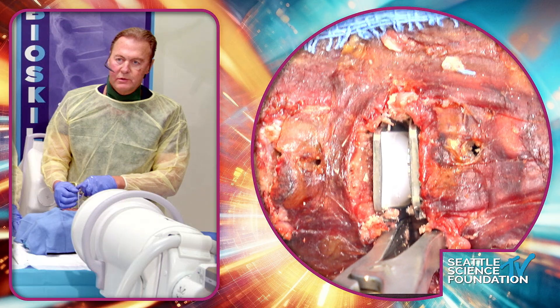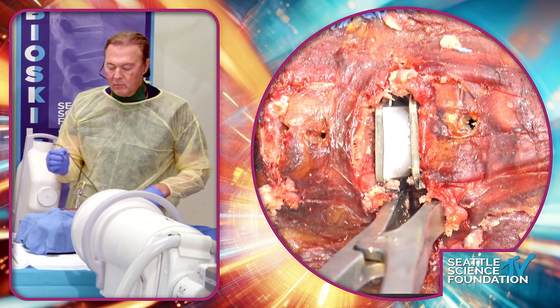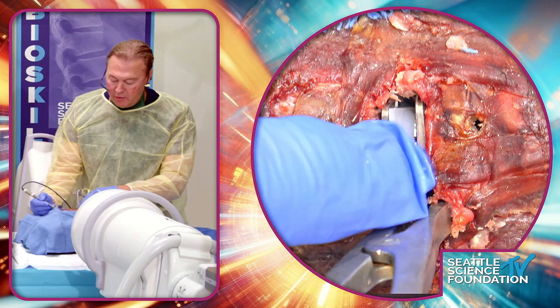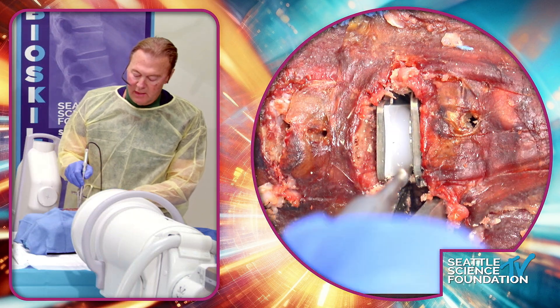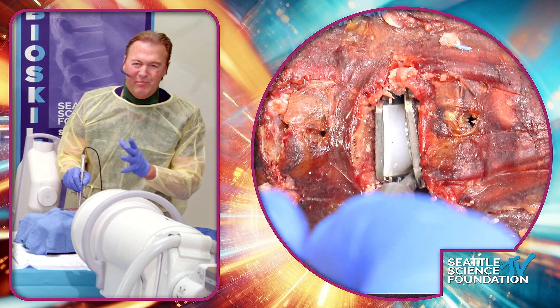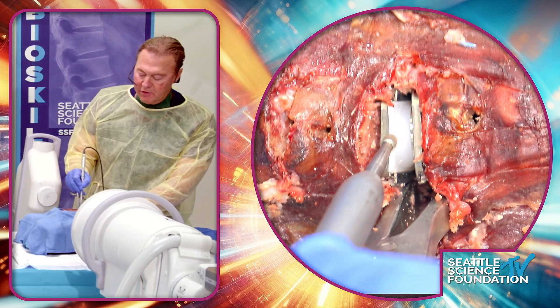I like to put the spreader in on the side and open the space directly. You can see how the dome becomes more exposed with that distractor. You can always catch enough lateral end plate to give you distraction force — sometimes I'll even put it on the metal portion of the disc and open on the lateral side, especially if you have somebody with poor bone quality. Normally this would be adherent, and then I take the drill and cut the dome right off.